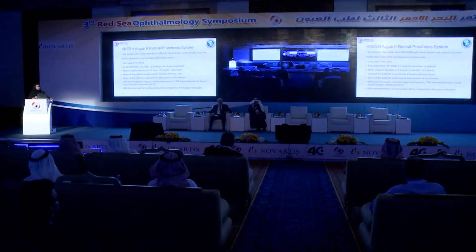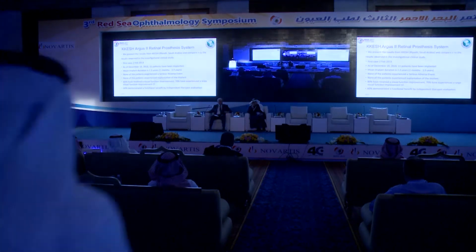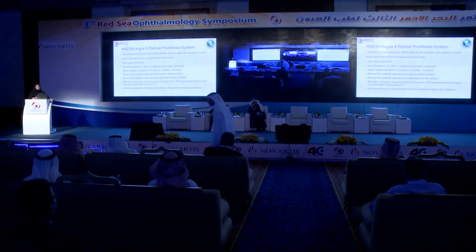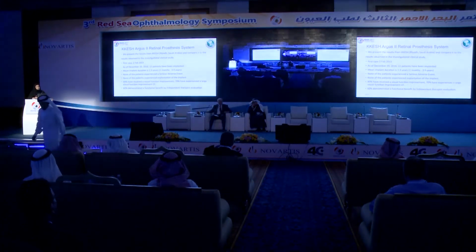We present here the results of King Khalid Eye Specialist Hospital compared to the results observed in the investigational clinical study, the international one. The first case was implanted on the 2nd of February 2013, and by December 19 this year, patient number 11 has been implanted. The mean implant duration is 2.3 years, from 1 month to 3.9 years. None of our patients experienced a serious adverse event. None of our patients experienced explantation of his implant.